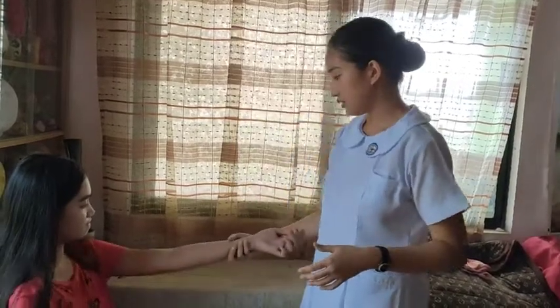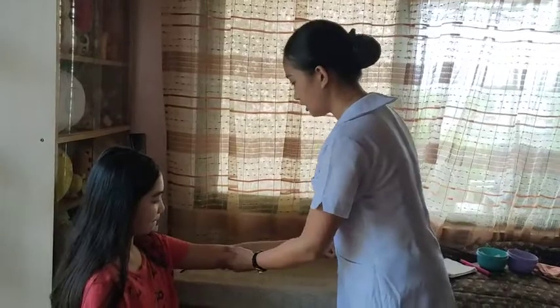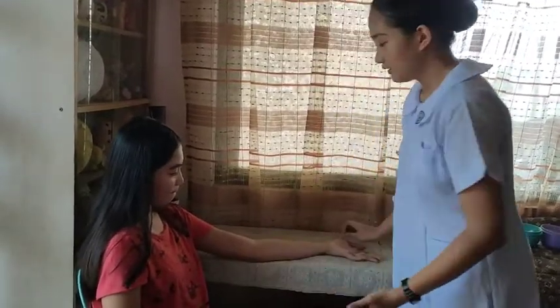We will now proceed to pulse rate counting. Pulse rate is also known as heart rate — we will count the number of heartbeats per minute of the patient. First, we assist the patient to a supine or sitting position with the arm next to the body and the palm facing downward. With this position, we can easily access the radial artery of the patient.